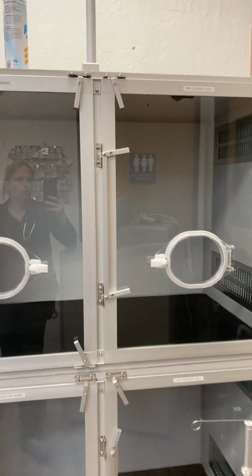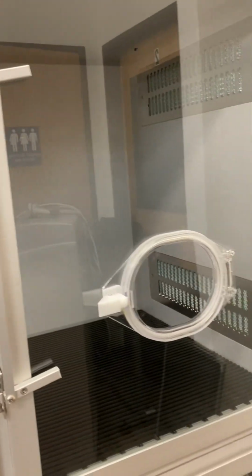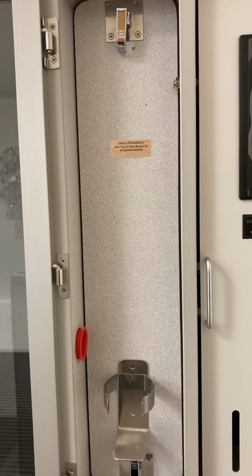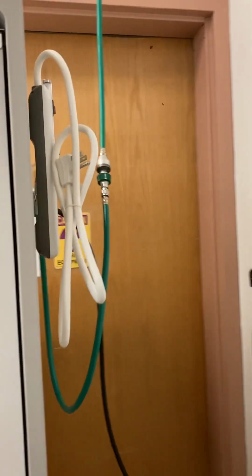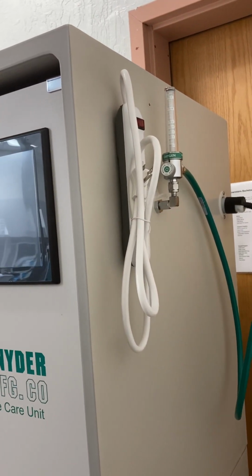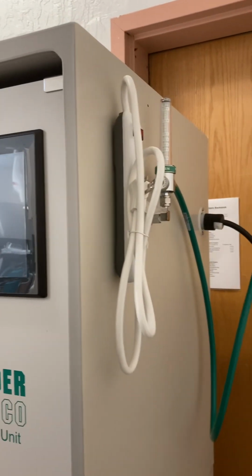So first of all, there's 3 compartments. Compartment A is here. This is where the patients go. Compartment B houses the soda lime, the condenser coils, and the drip tray. And compartment C is the control panel. Off to the side, you also have the power cord, the oxygen flow meter, and an additional power cord to hook up fluids and pumps to, and etc.